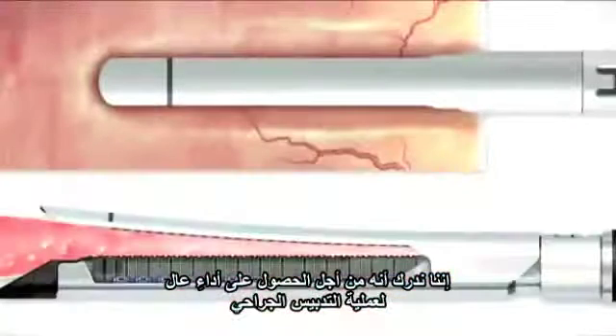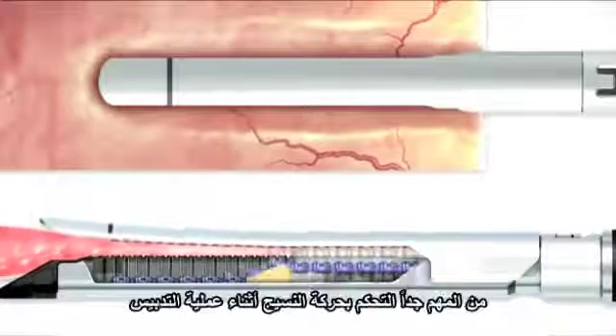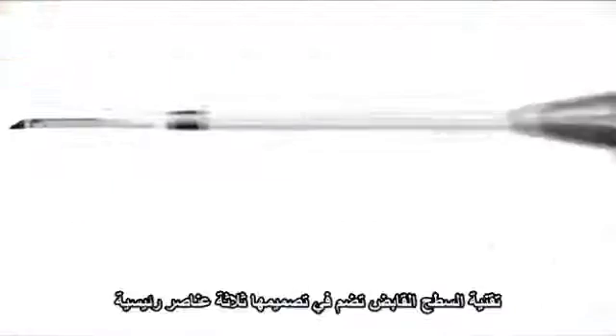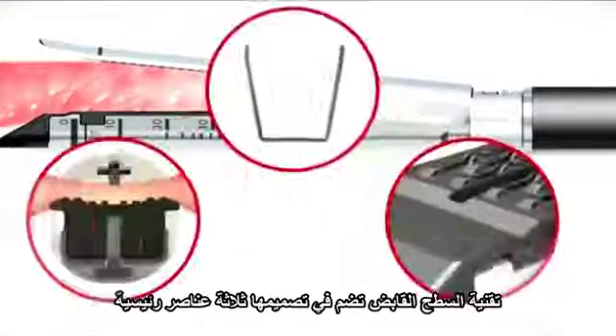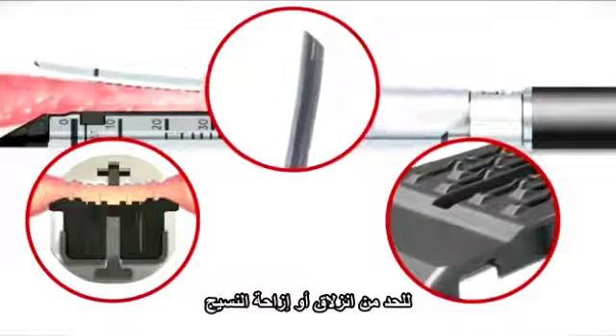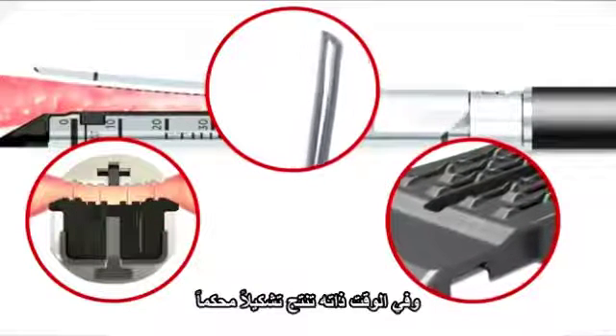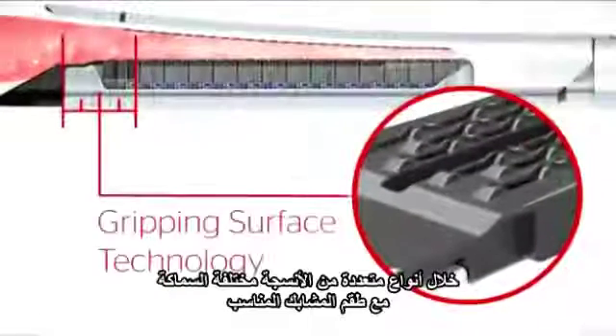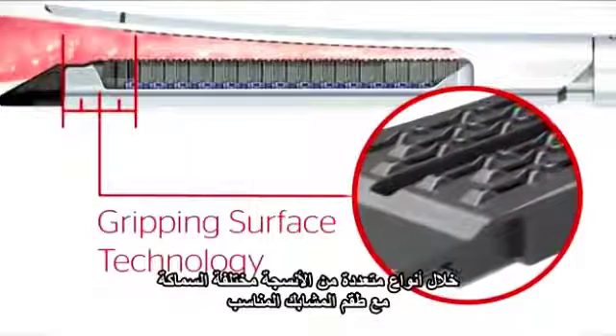We recognize that for optimal stapling performance, it is critical to control the movement of tissue during the stapling process. This GST system incorporates three major design elements to reduce tissue slippage or movement while delivering reliable staple formation and precise tissue transection across a broad range of tissue thicknesses with each reload.